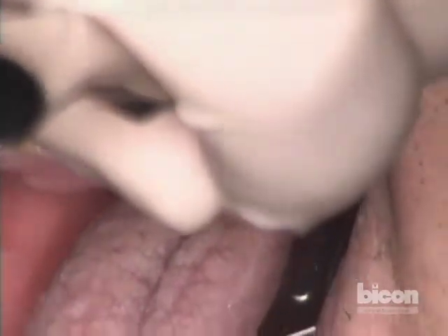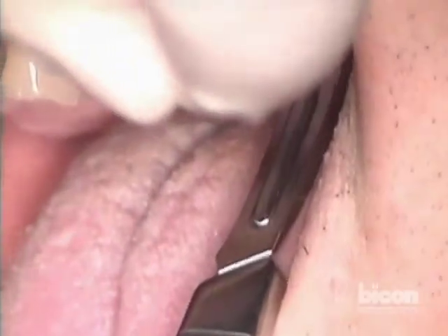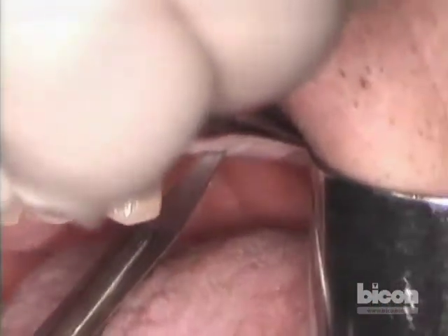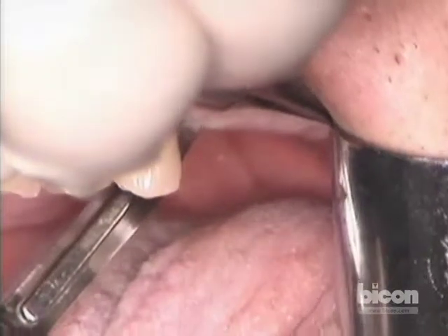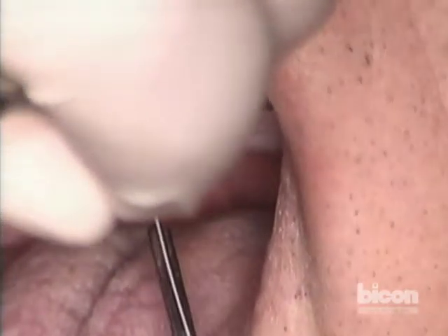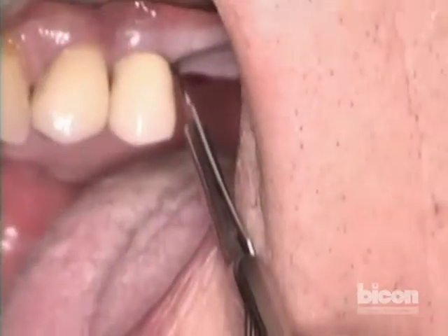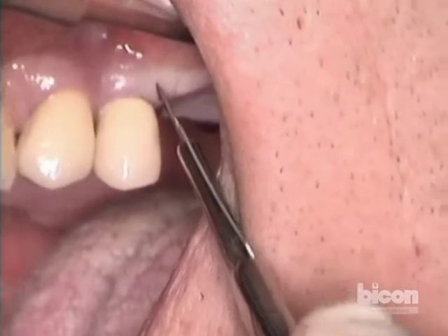The design of the incision is going to be a trap door with the beginning of a paddle shape that will come from the facial, encompassing all of the crest, and going all the way onto the crestopalatal corner, right onto the palatal slope ever so slightly. Then we will turn around and complete it with a nice wide base on the facial.